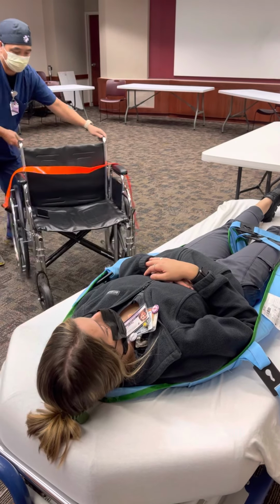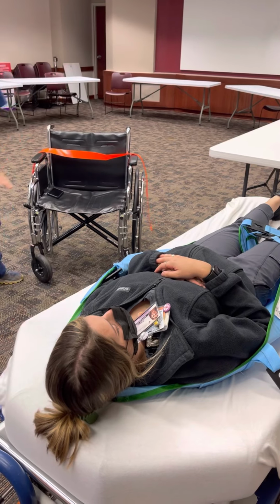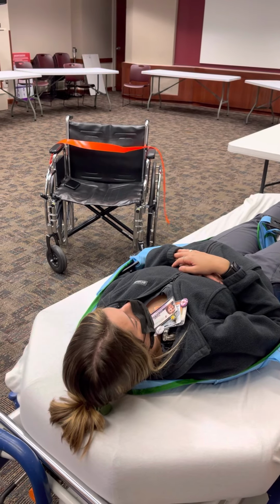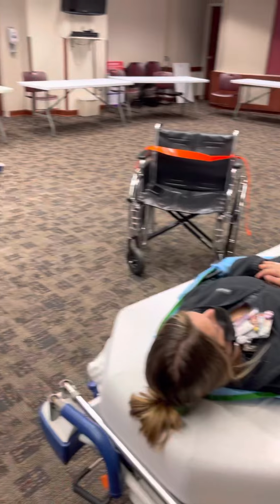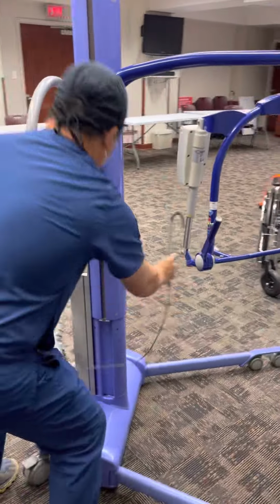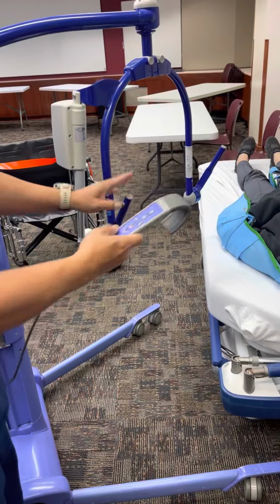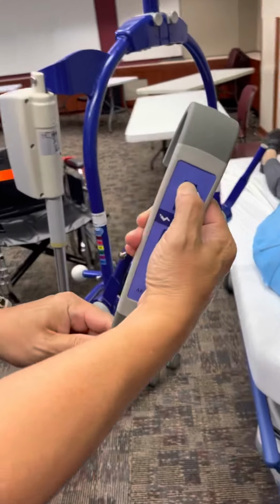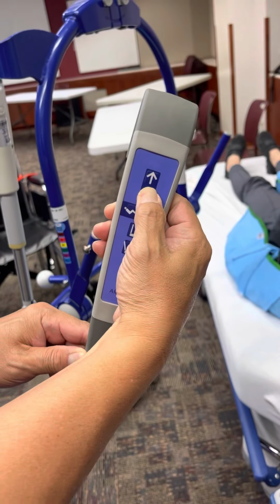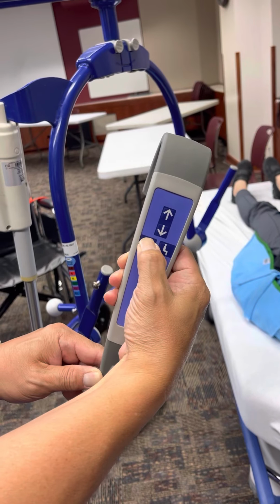And then I need to get the chair ready where I want her to transfer to. So I'll put it right here. And I'll get the sling lift ready. So the lift has two controls, one here on the body and one over here on the handheld control. So this control here, this goes up and this goes down. This will sit the patient up and this will lay the patient down.